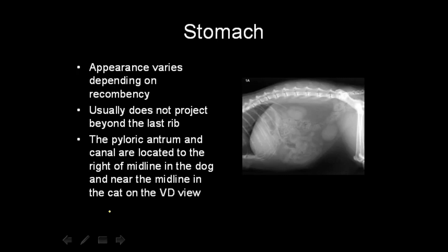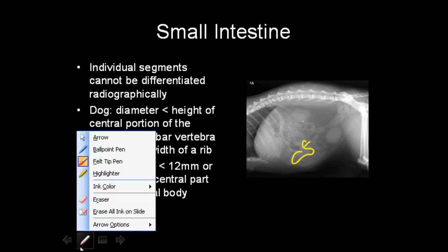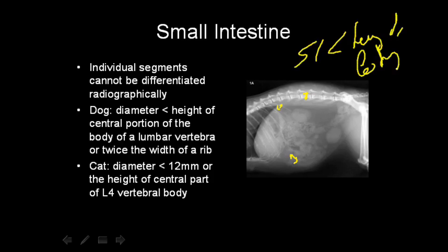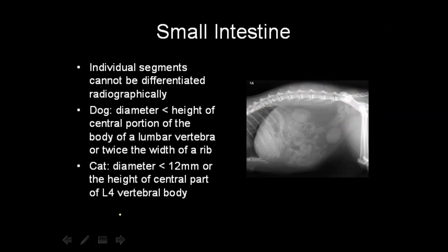The pyloric antrum is near the midline and to the right in dogs, or mostly on the midline in cats on the ventrodorsal view. For the small intestine, we can see loops all over the abdomen and individual segments cannot be identified. The diameter of the small intestine should not be wider than the height of a mid-lumbar vertebral body or twice the width of a rib. In the cat, it should be no more than 12 mm or the cranial-caudal height of L4.